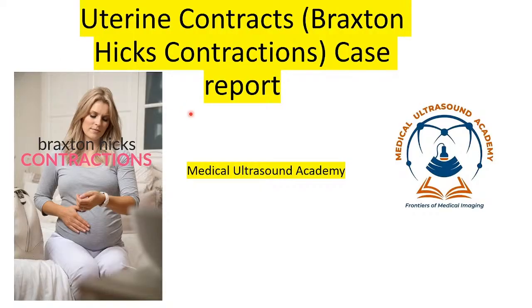Hello and welcome. In this presentation, I'm going to discuss one of the concerns of most pregnant women. So let's talk about uterine contractions, the so-called Braxton Hicks contractions. I also have a case report that I did. I will show you the ultrasound images of how Braxton Hicks contractions appear sonographically.